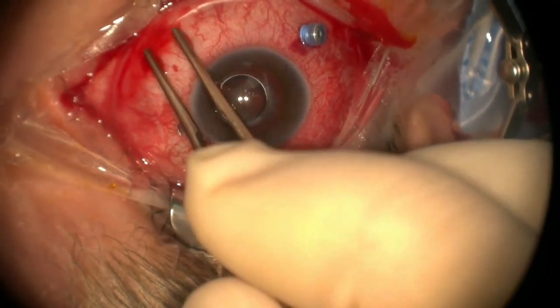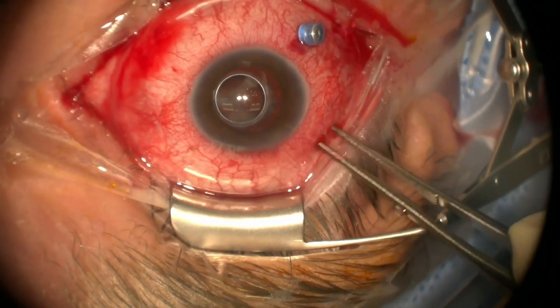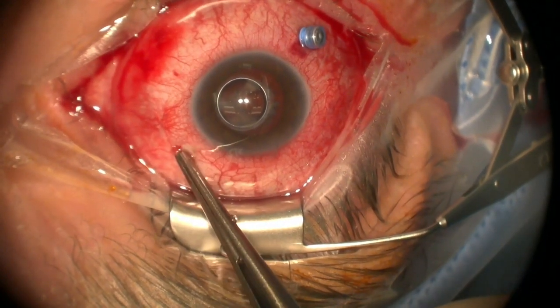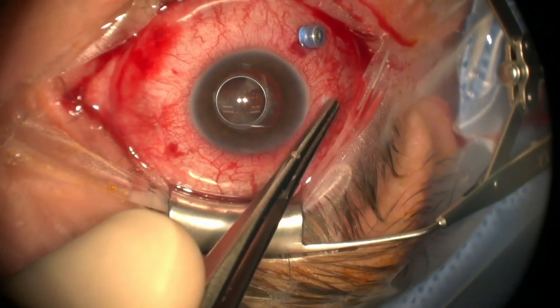How you feeling now, Eric? Is that pinch there? No. Nope. How about over here? You pinching? A little something. A little something. Okay. How about over here? Good. So I'm going to put the next cannula in.